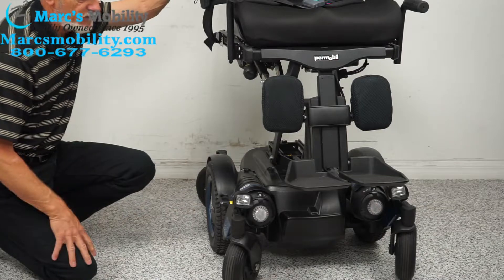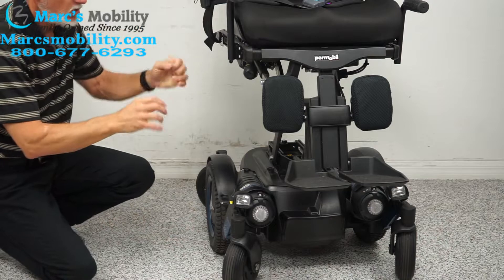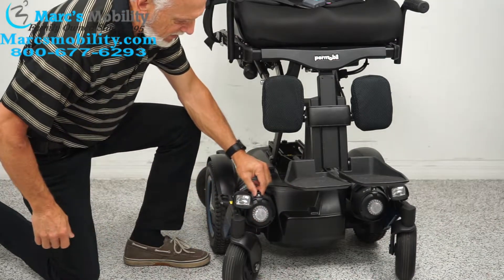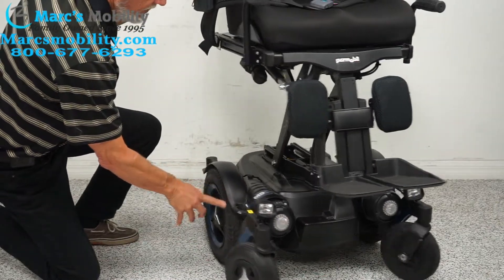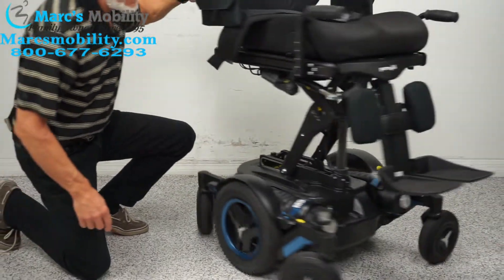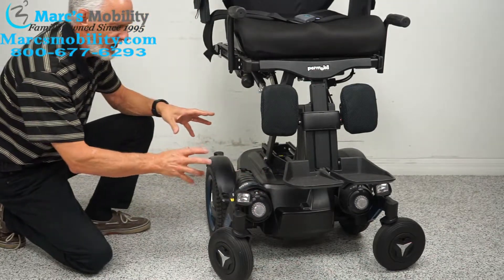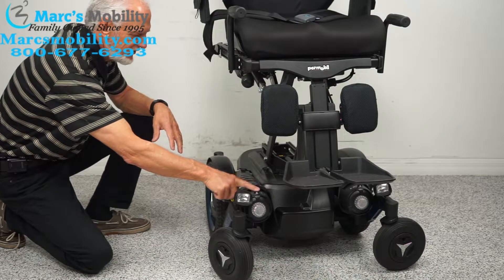To push the chair manually, turn the power off — you want no resistance in the motor. You'll see this little lever on top near the reflector. If you push the handle inward, it unlocks the wheel. Do both motors, then you can roll it straight. When you're done, make sure you put it back in gear.